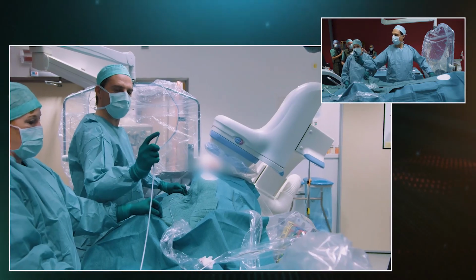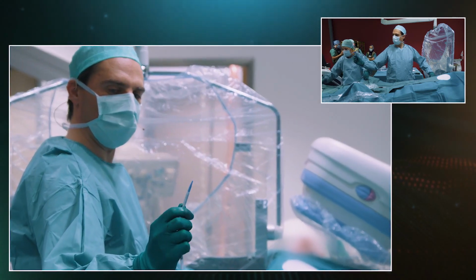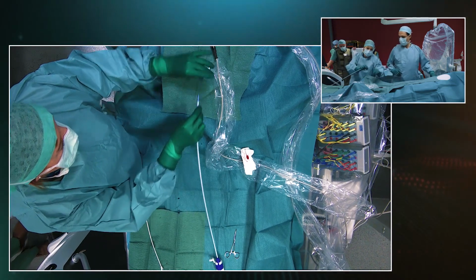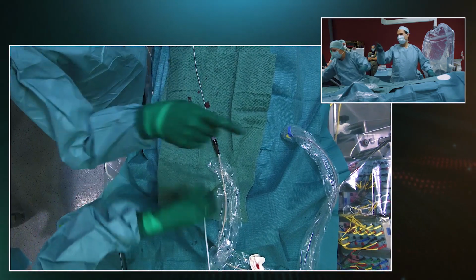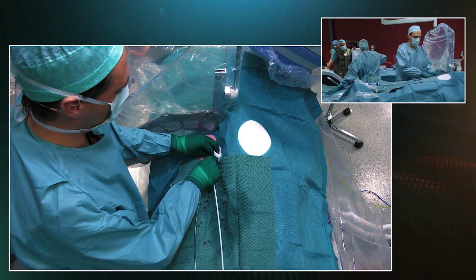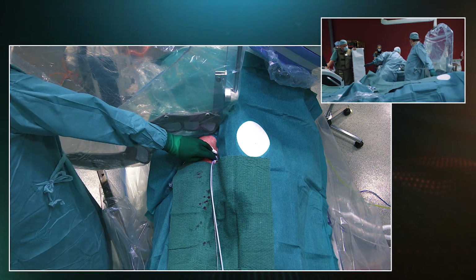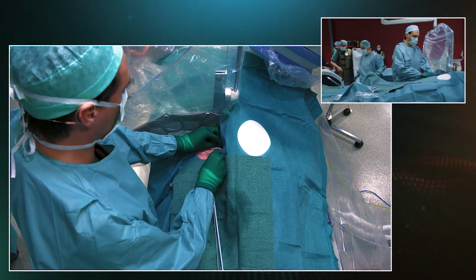Note how the tapering between the dilator and the sheath is very good, and the exposed piece of the dilator is very short. The tapering is very smooth, which means that it's usually easy to enter the skin. Sometimes we make an additional extra cut, and in particular it's easy to cross the septum with this sheath, 12 French inner diameter. So here it doesn't cross the skin. I will open the incision here, and then you will see that we won't have any issue to cross the septum.